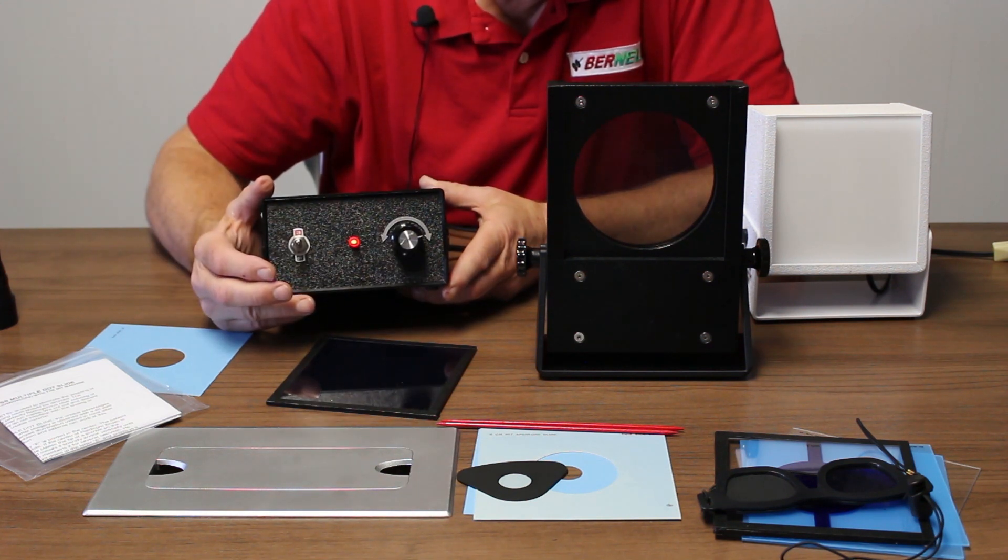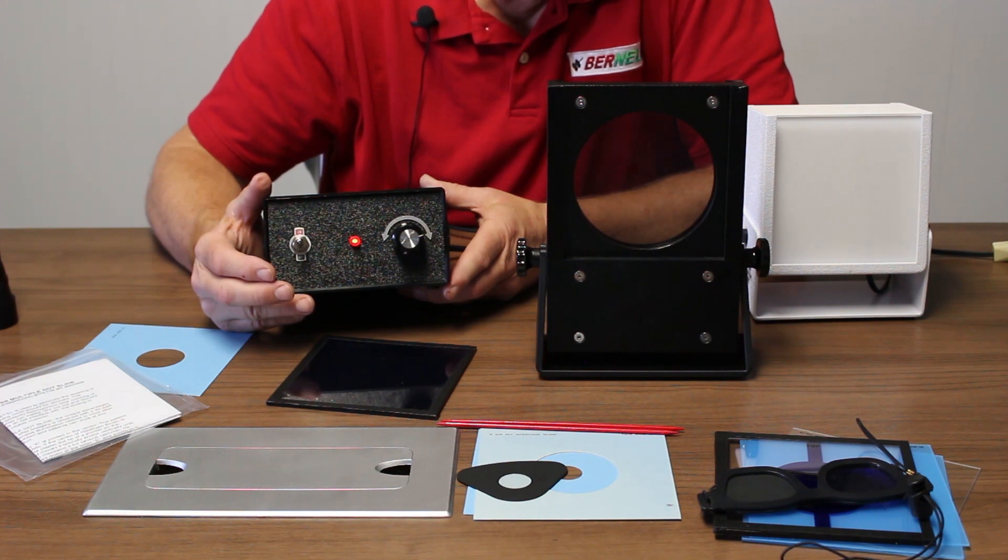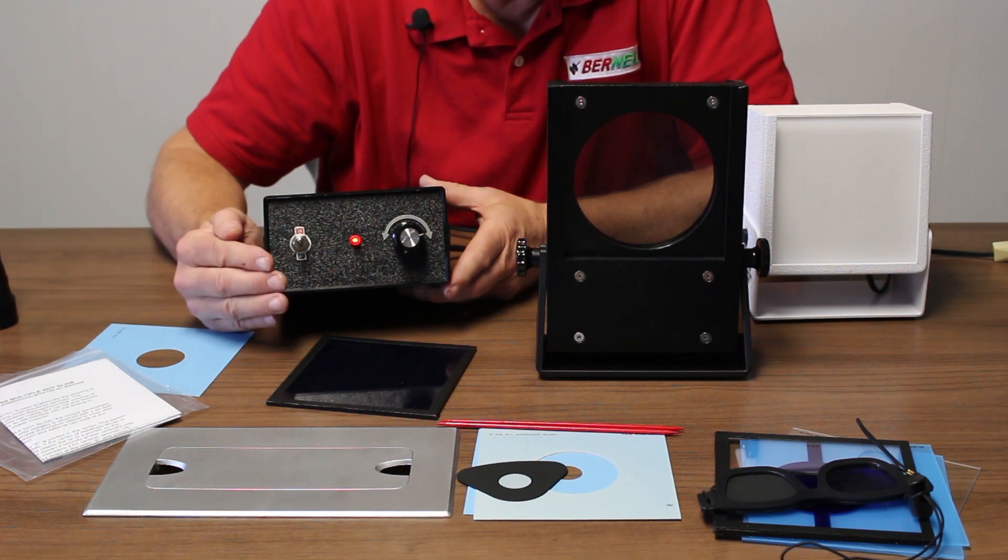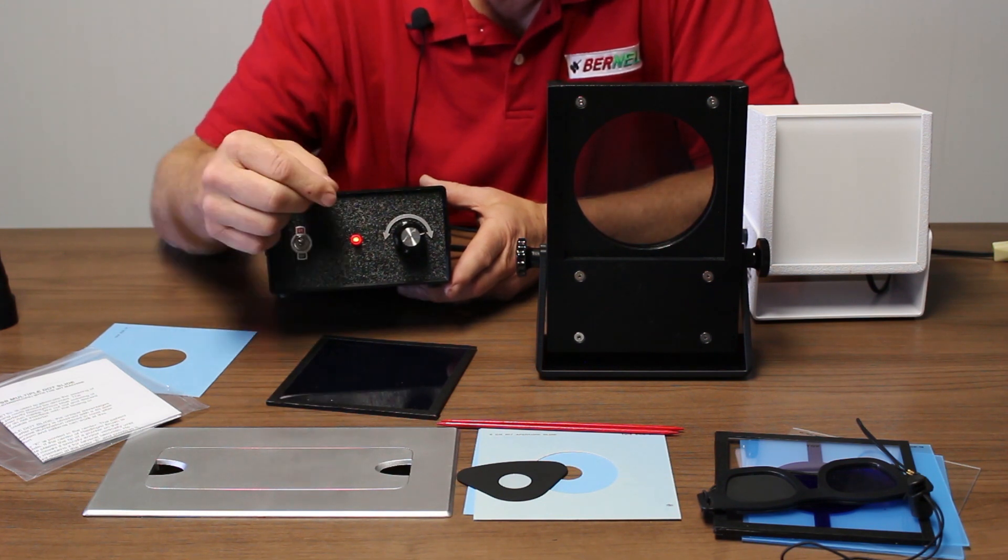To test the responses of the patient, sometimes they'll tell you they're seeing the brush when they're really not. First, you can show them with the good eye what they're looking for, so they know what they're looking for.